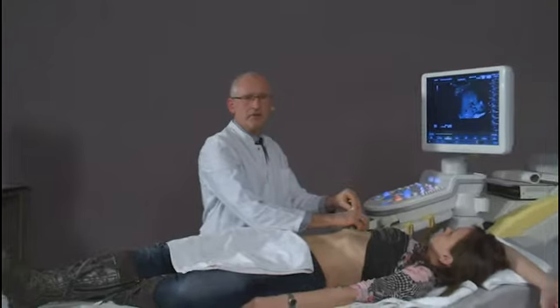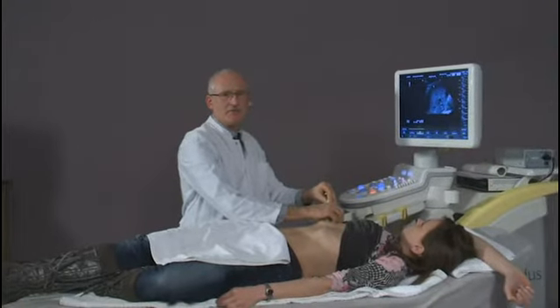This is of importance to make fast clinical decision in a patient under difficult conditions, perhaps during the night shift, to have with one transducer position very important information at one glance.